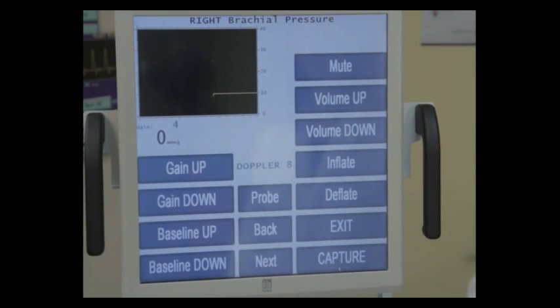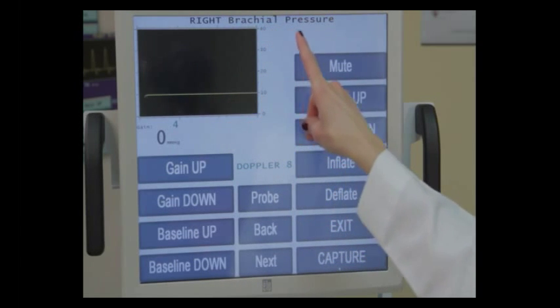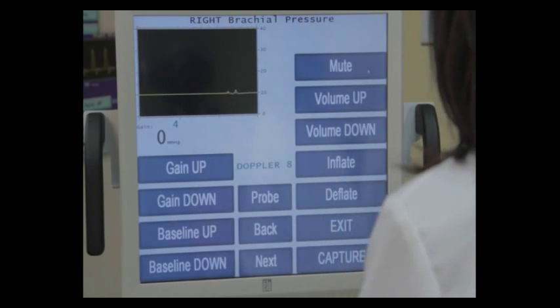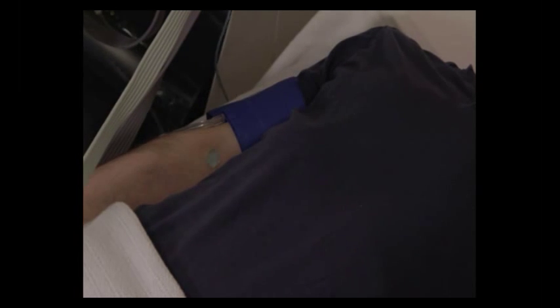If you'll notice, at the top of the screen, it's asking us for a right brachial pressure. So at this point, we're going to pick up our Doppler probe, and we're going to apply some gel to the right brachial area. Make sure the patient's hand is flat and facing the ceiling, palm up.